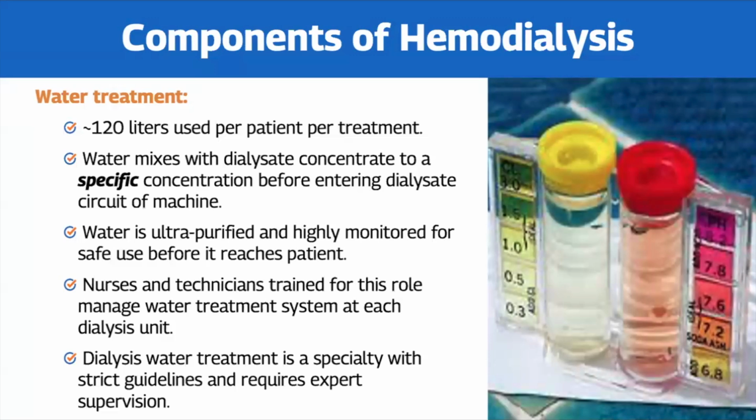Nurses and technicians are specially trained for this role in managing the water treatment system at each dialysis unit. And dialysis water treatment is a specialty with strict guidelines and requires expert training.